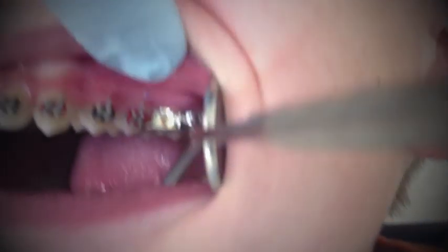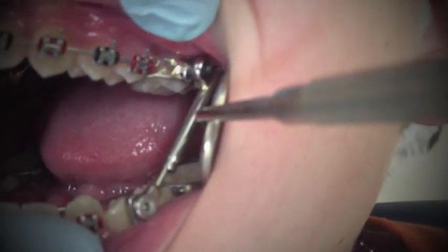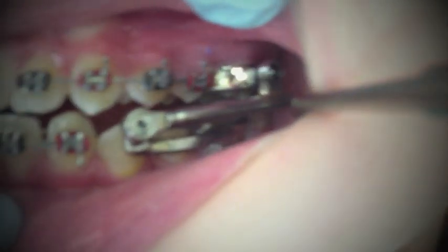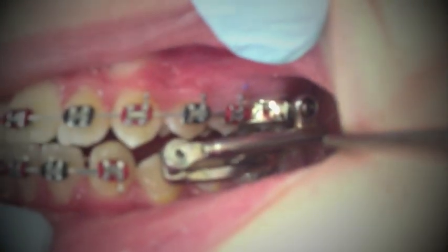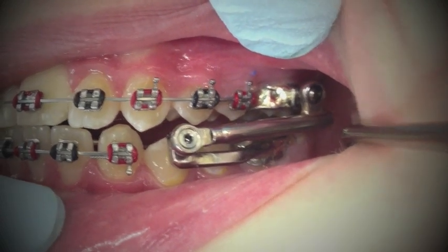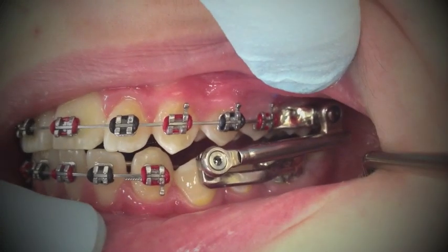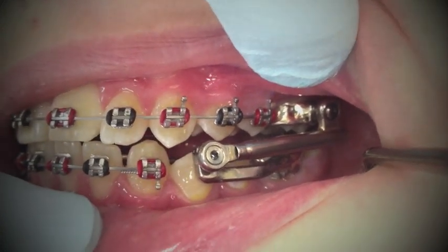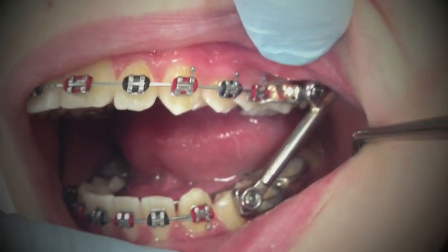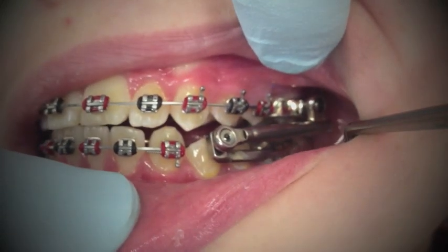Let's get a look at this — that's the top piston. Bite down. His jaw can only go in that position there, and you can see his canines are in a Class I position. Without the Herbst appliance he is Class II. You can see that thing hinging on the top — bite down.